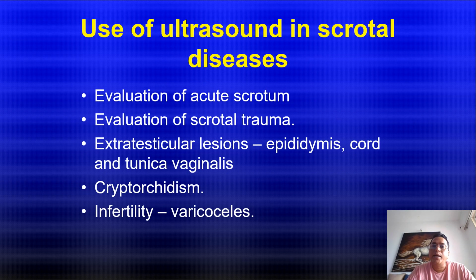in our day-to-day practice. There are various indications for which a patient might be referred to you in your clinical practice. One of the commonest is any kind of acute pain in the scrotum. Second is any kind of trauma. Then certain lumps felt by the patient, it could be a testicular lump or an extratesticular lesion like an epididymis, cord lesion or tunica vaginalis.